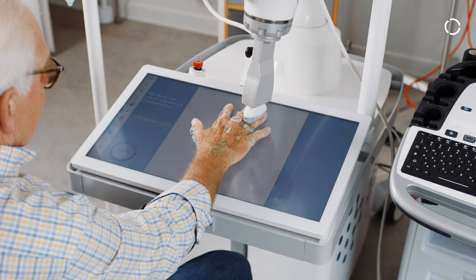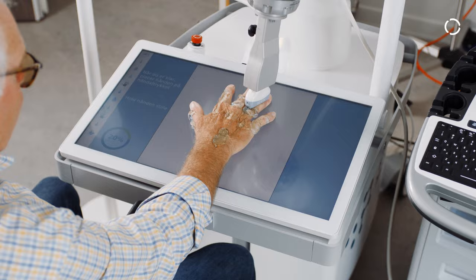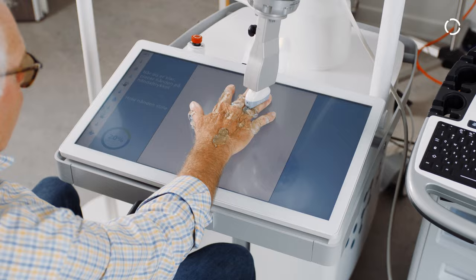The robot is a tool like many others, and it works really fine. It's easy to use. There's no reason to be afraid of it—it doesn't go anywhere.